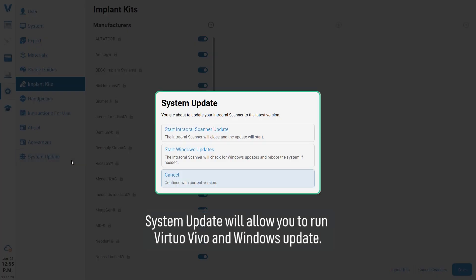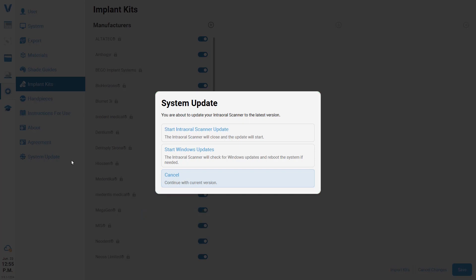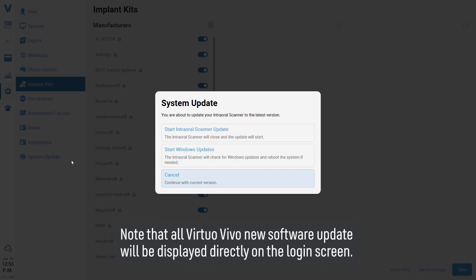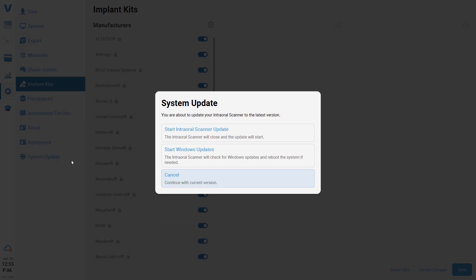System update will allow you to run Virtual Vivo and Windows updates. Note that all Virtual Vivo new software updates will be displayed directly on the login screen.